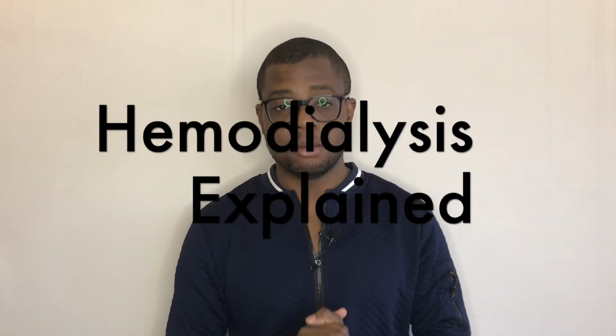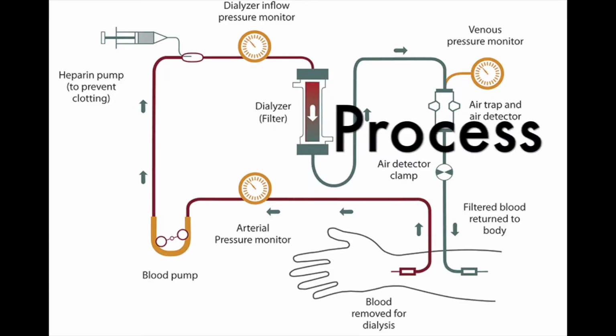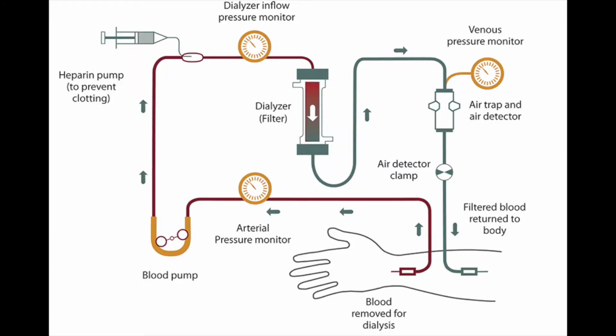We are here in hemodialysis. Okay, so we are going to start off with the process. What is the process that is involved? So you can see blood is removed for dialysis from your artery. Then it goes through the first pressure monitor, which is your arterial pressure monitor.